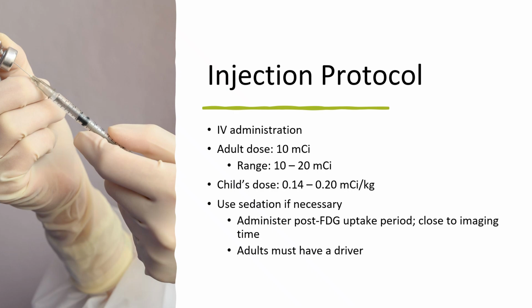Sedation, like I said, can be used if necessary. It's really rare, and you want to give it close to the imaging time, depending on what you're doing. If they're just taking something like a Xanax, you would have them take it about a half hour, 20 minutes before your imaging. But if you're actually sedating them with IV medication, then you want to do that pretty close to right when you're putting them on the camera. And if you do end up having to use sedation, they have to have a driver.